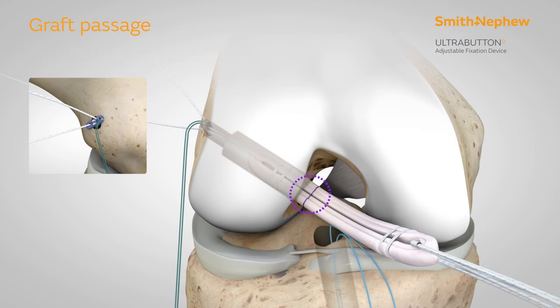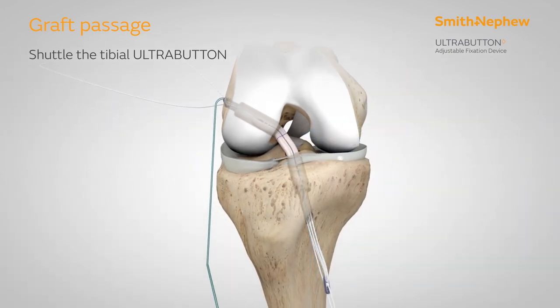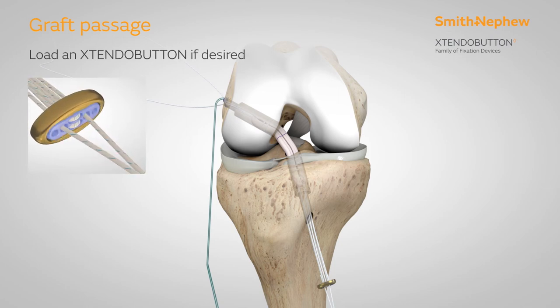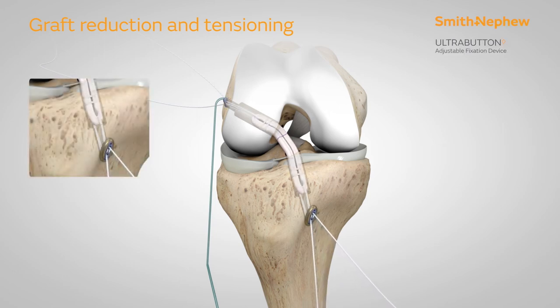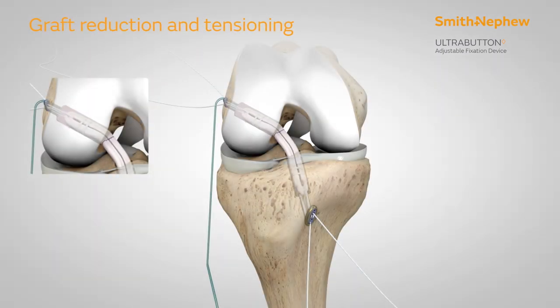Shuttle the tibial ultra button sutures through the tibial tunnel and pull the graft into the socket. A small extendo button may then be loaded onto the tibial ultra button to increase the button size. Reduce the tibial ultra button until the graft is bottomed out within the tibial socket. Return to the femoral ultra button and further reduce the button to achieve the desired graft tension.